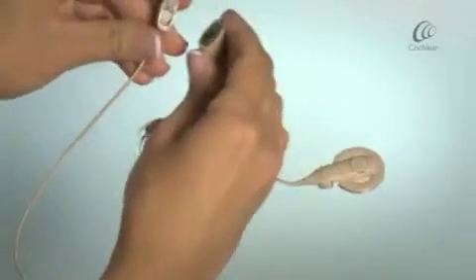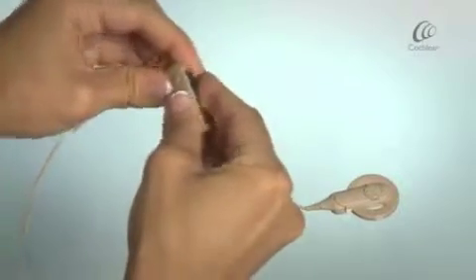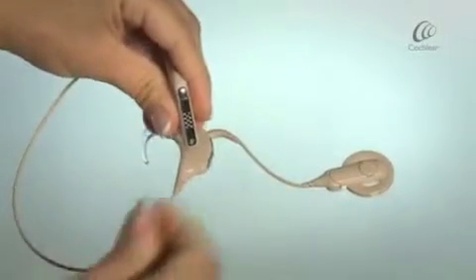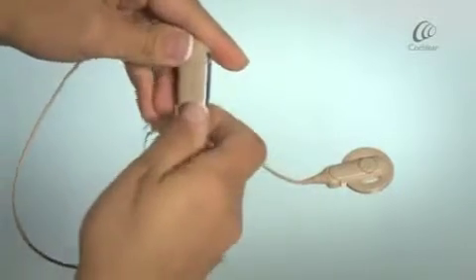Join the battery module and the lower end of the Lightwear cable at an angle and twist together. Move the lock from the right to the far left position.